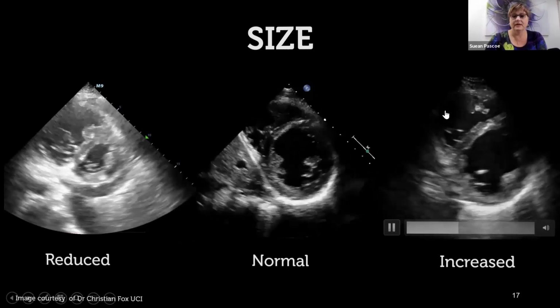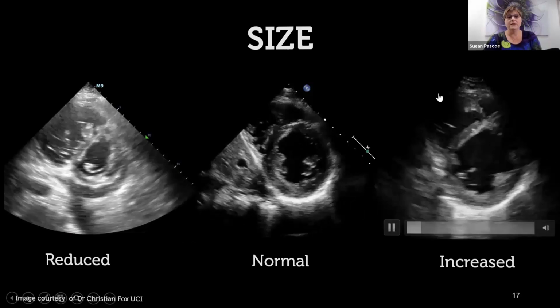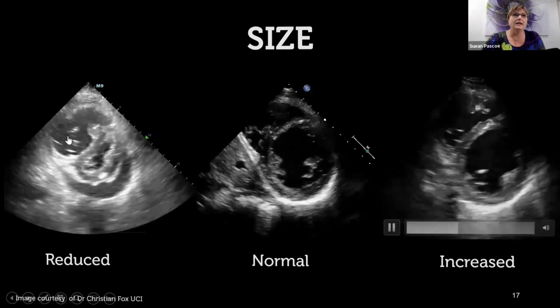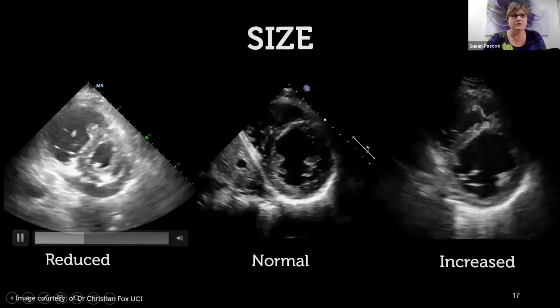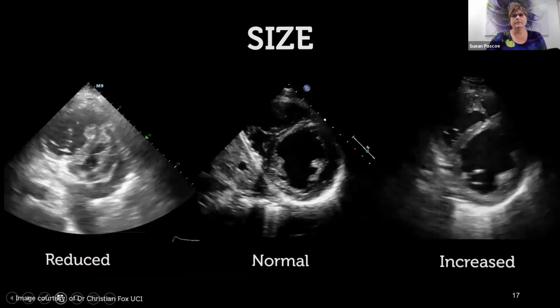And you can see that sometimes the motion of the septum appears to be bowing inwards, particularly over here. We have a really quite large right ventricle and there is bowing of the septum towards the left ventricle. That's called paradoxical motion, which we'll talk about a bit more in a minute.